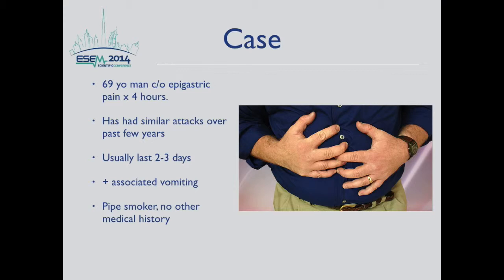Emergency bedside ultrasonography enables the physician to confirm a high-risk diagnosis, decrease the time needed to mobilize resources, or even transfer the patient to a referral center if necessary. This one exam will save lives when incorporated into the regular practice of physicians involved in the evaluation of acutely ill patients.